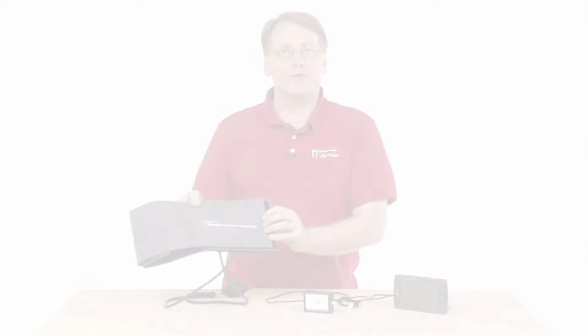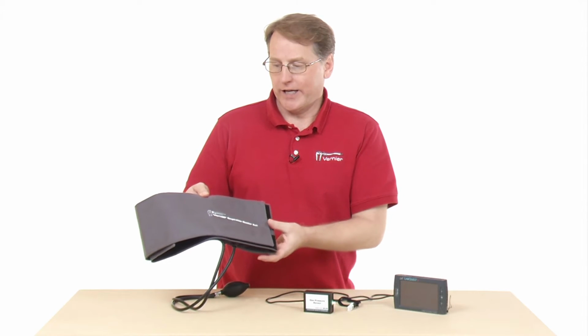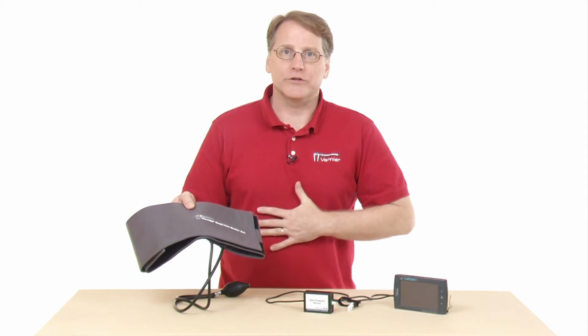This is the respiration monitor belt. It measures the respiration rate of a human. So you might use it in a physiology lab, comparing exercise, holding your breath, things like that. It's essentially like a giant blood pressure cuff, arm cuff. Really what it's doing is measuring the diaphragm pressure across your chest.